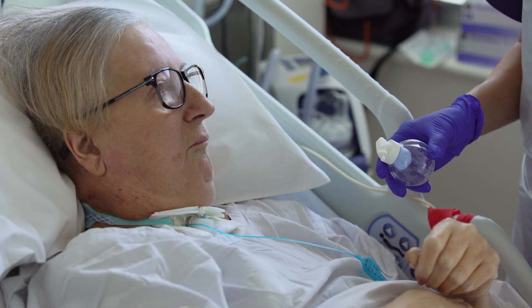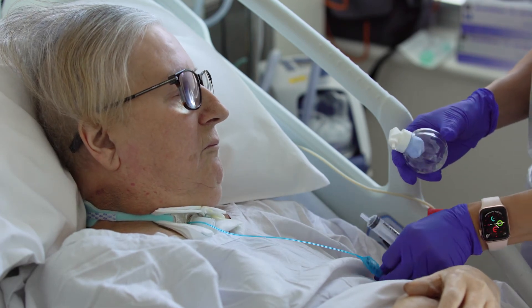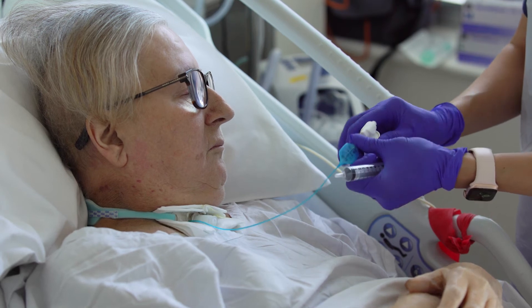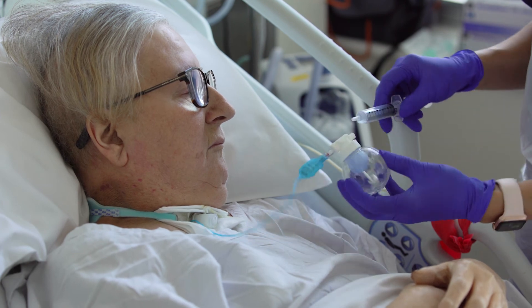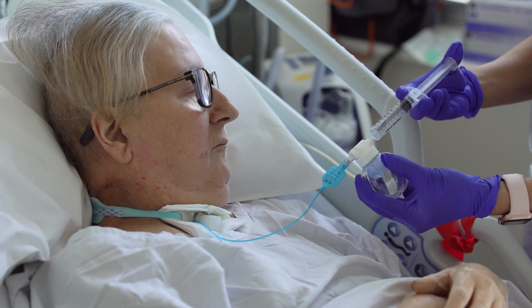If the patient is using a Passy Muir valve, this must be removed prior to connecting the cuff manager device and inflating the cuff. Attach the device to the tracheostomy pilot line. Using a 10ml syringe, inflate the blue balloon in the chamber until it is 2 thirds to 3 quarters full.